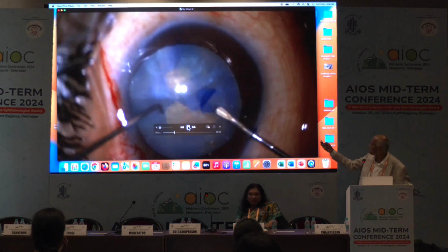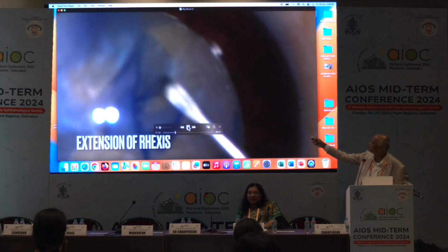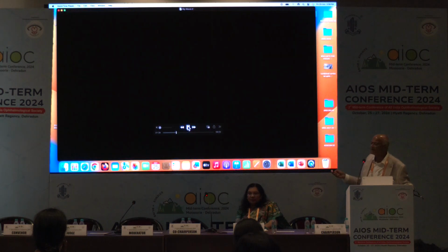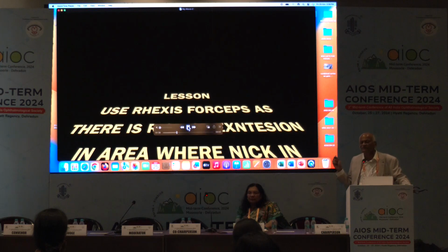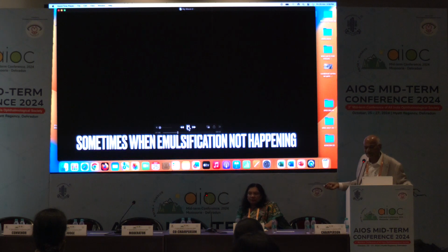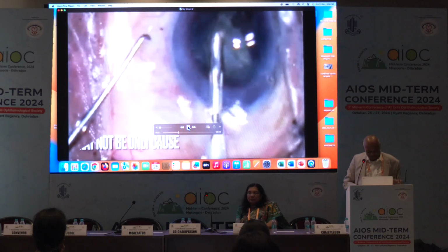See now, I am trying to do it. Can you see this? What is happening? It is going in the periphery. See this. Here also, just because of the fibrosis, the rhexis is irregular, and so here the risk of extension is so much. So you will have to be very cautious. Now see, this is what I am doing, the 1 minute.